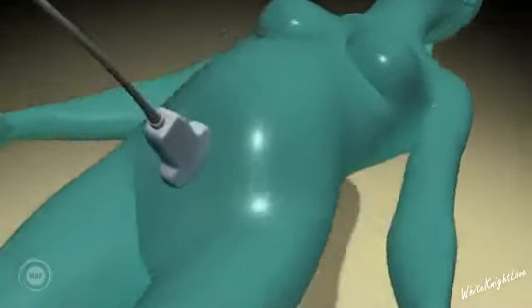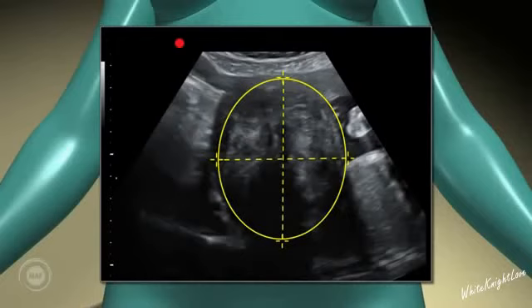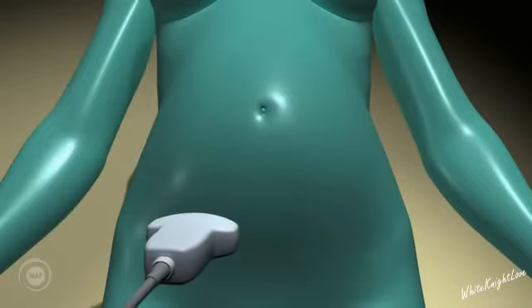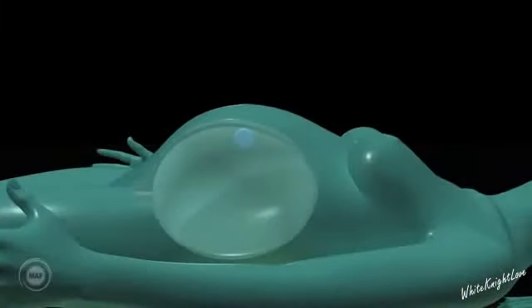Fibroids. When scanning fibroids, it's important to describe their size in terms of volume. 2 measurements are taken in the longitudinal plane and 1 measurement is taken in the transverse plane. The fibroid should then be located in relation to the uterus to determine whether it is fundal, anterior, posterior, or cervical. Also described as the fibroid's position within the uterine wall.